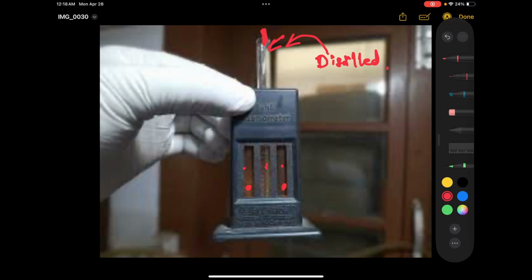Now what you are supposed to do is, with the help of two fingers, you hold the comparator. With one finger, you hold the hemoglobin tube, and with another finger, you keep this uplifted stirrer. You hold it like this, at one arm length in bright light, and look along the horizontal line. You give the measurement of whether it is matching or at what level it is matching, and that gives your hemoglobin estimation. So this was all about how to estimate hemoglobin.